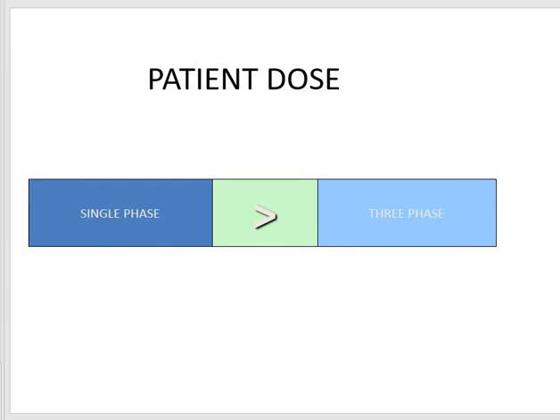Therefore, patient dose is also significantly reduced when using three-phase 6-pulse power supply, and even better when using three-phase 12-pulse power supply.